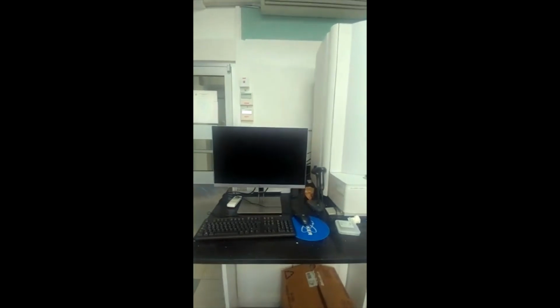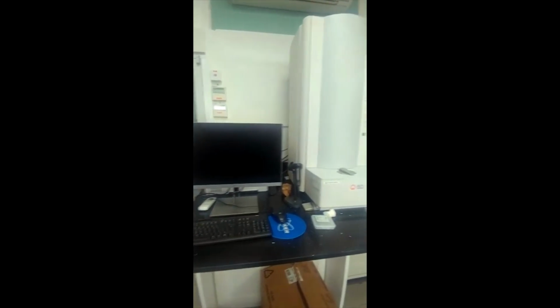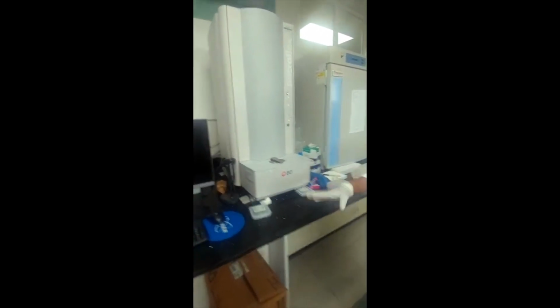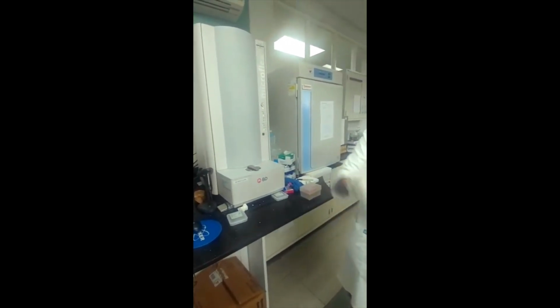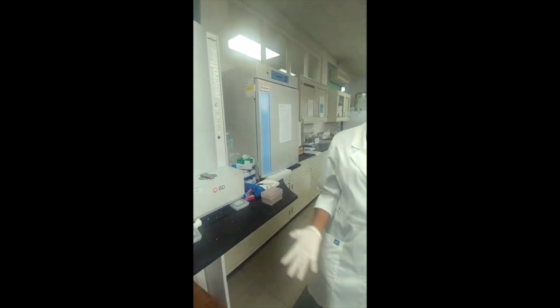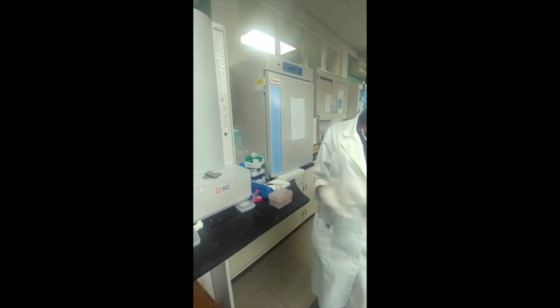And all these machines are connected to our computerized system, Miss? Well, right now we have 2 of them that are, and we're working soon to have this one added. And so all of them will feed information into this one space where all the results are collated and interpreted, and reports are generated for the staff and the patients.